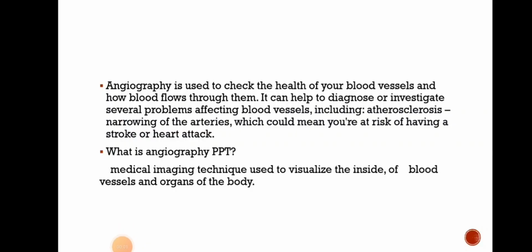Angiography is used to check the health of your blood vessels and how the blood flows through them. It can help to diagnose or investigate several problems affecting blood vessels, including atherosclerosis, narrowing of arteries, which could mean you are at risk of having a stroke or heart attack.